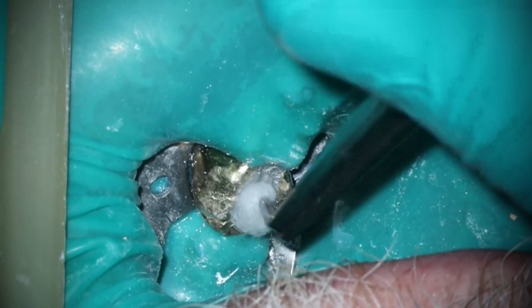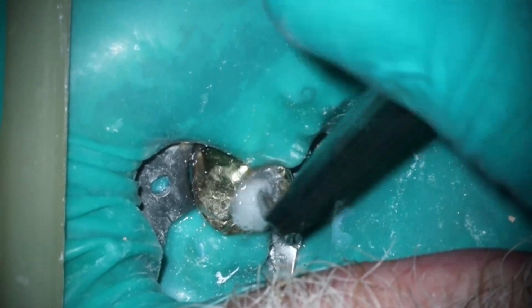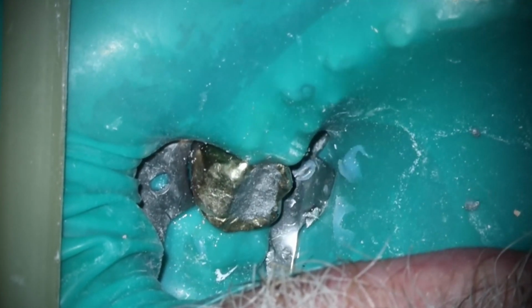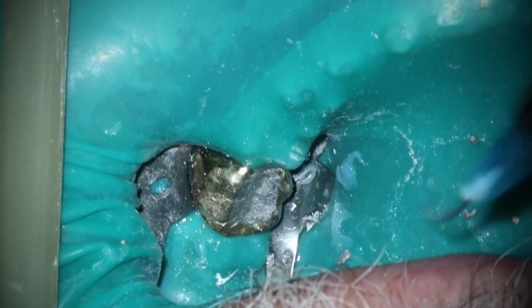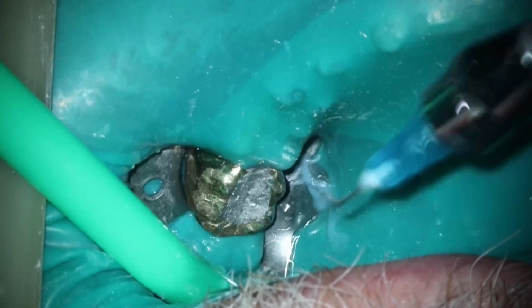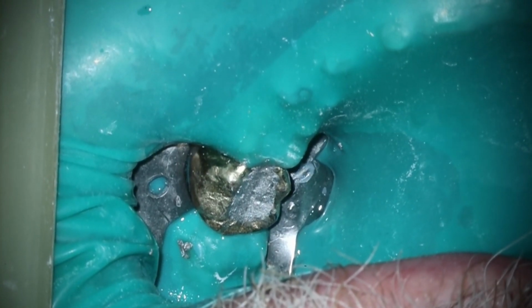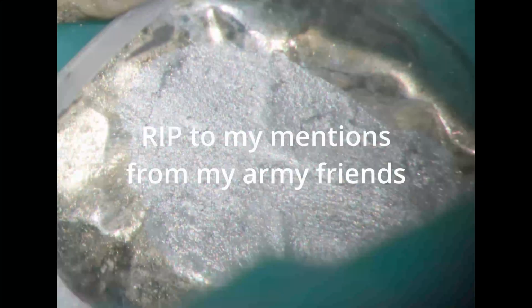So anyway, I think here, yep, we're just polishing this up, a little bit of cotton pellet to get it looking beautiful. I was pleased with my terrible amalgam. It's going to work because amalgam always works. That's the beautiful thing about it. We checked the bite. It was rock solid. But I always am hesitant putting amalgam restorations on the internet because there are people who are absolute artisans at it, and I am not one of them. So anyway, final picture here just to make sure everything looks beautiful, and you'll see that still photo in here in just a second. And then the image is coming up as well for the final radiograph.